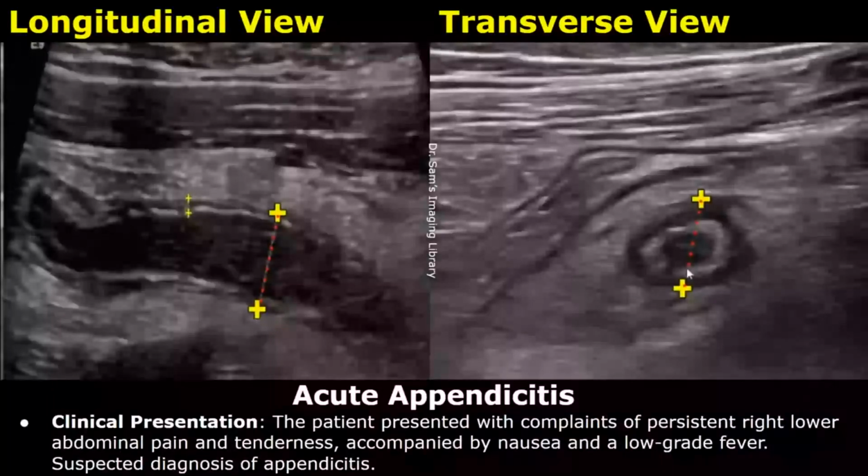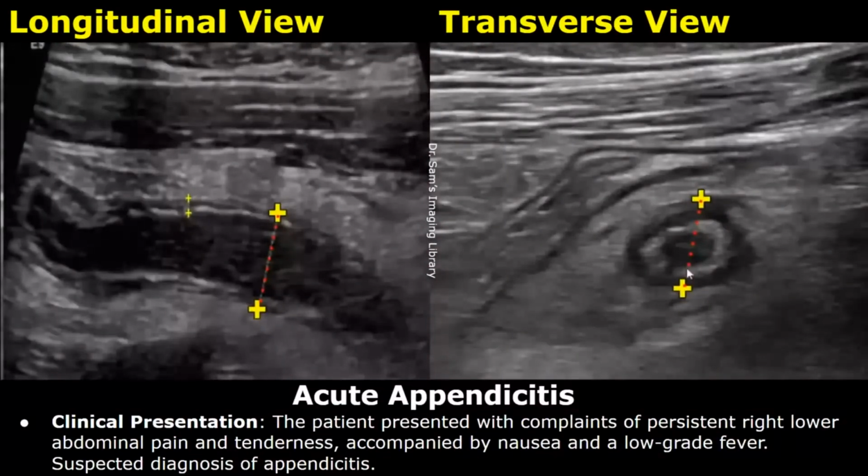And this video is about appendix ultrasound reporting. We will see how to write findings and impression for diseases related to the appendix, which mainly includes appendicitis.